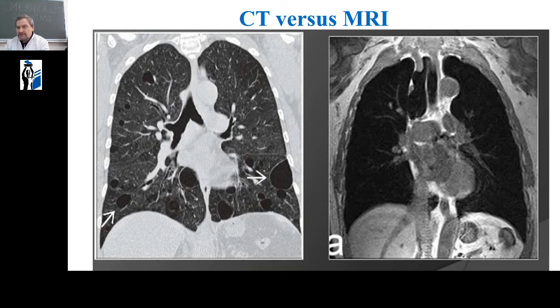Such an assessment is not possible with magnetic resonance imaging, unlike the assessment of brain structures.